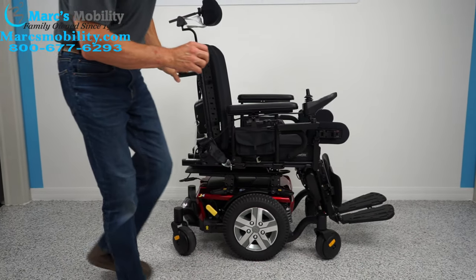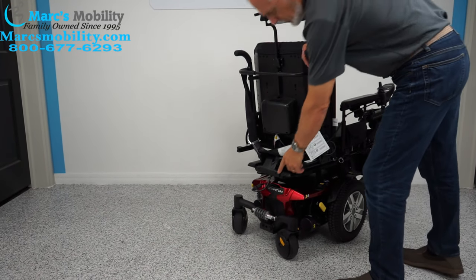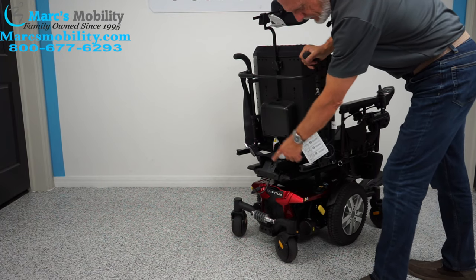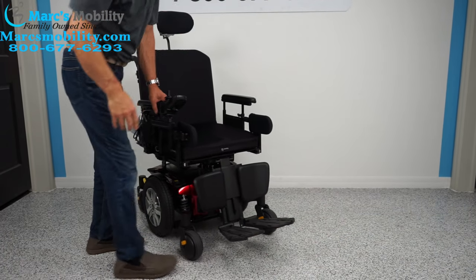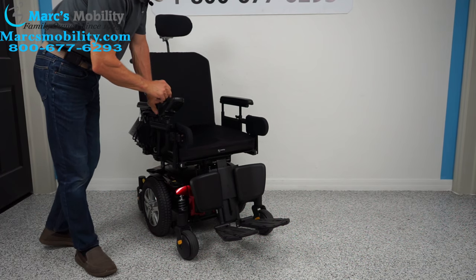The suspension on these chairs is just phenomenal. If you look at the back of this chair, there's adjustable suspension right there for the forks in the back. You have the same shock absorbers — two more in front as well, one on each side.